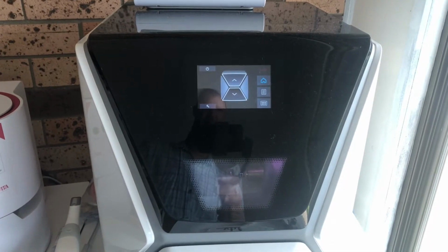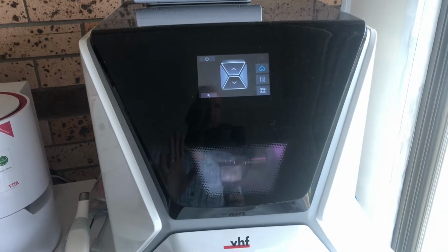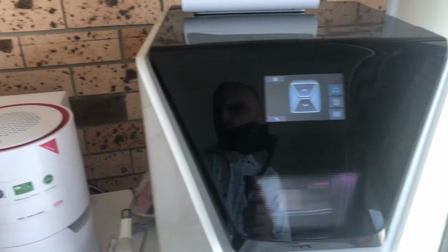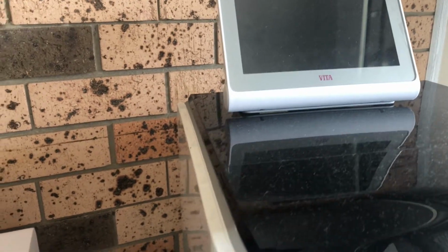Okay, just doing a quick video just about the VHF Z4. So if you did want to know some information about this, it's an incredibly simple system to use. So the good thing about the Z4, as you know, is it links into the Trios software.